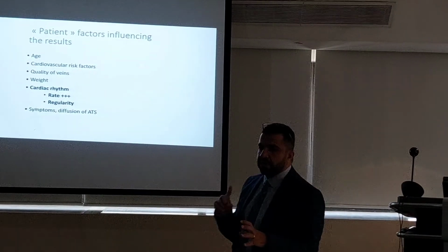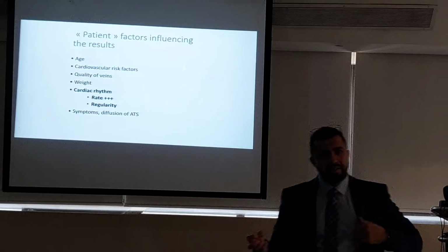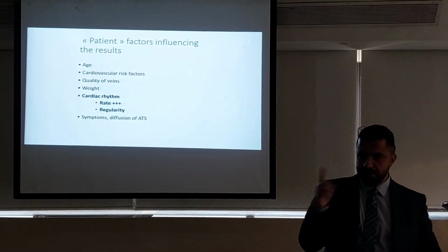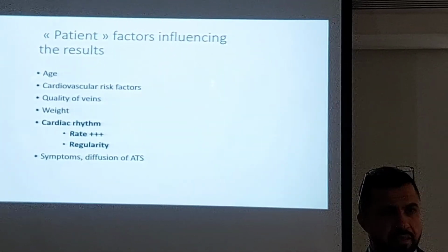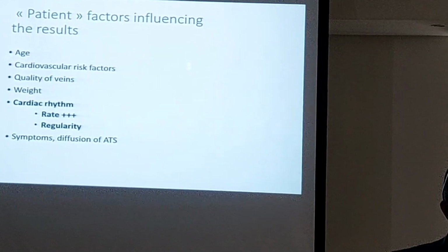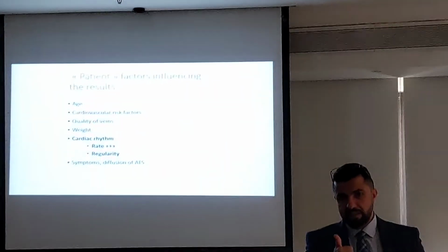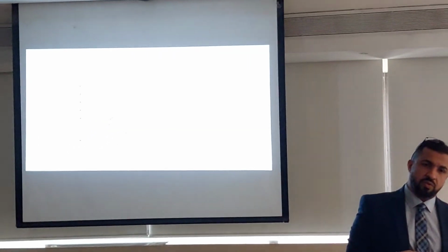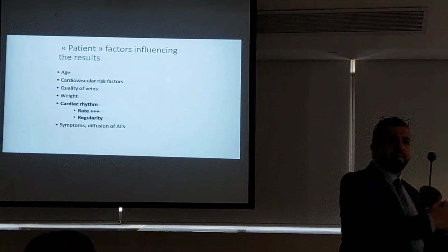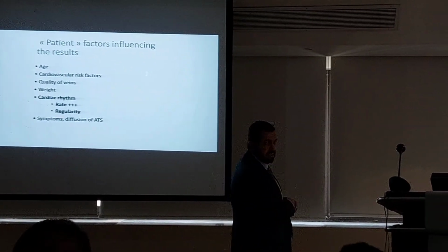That's because we are using a very fast rotation speed. With the maximum mA I'm using, there is still not enough quality to be diagnostic. Because the higher the rotation speed, the shorter the rotation time, I need higher mA. In an abdomen CT scan for a very obese patient, I add volume, but not because I need more contrast, because I need a higher flow rate, better opacification. With the higher flow rate, I have to keep the bolus time, so I will add volume. Make sense? Okay.